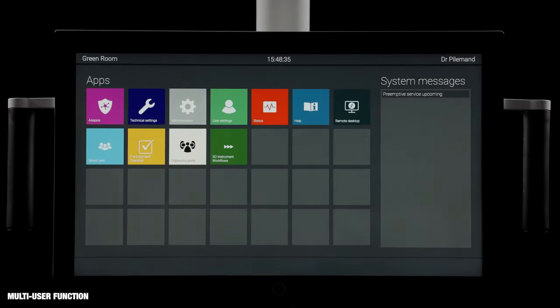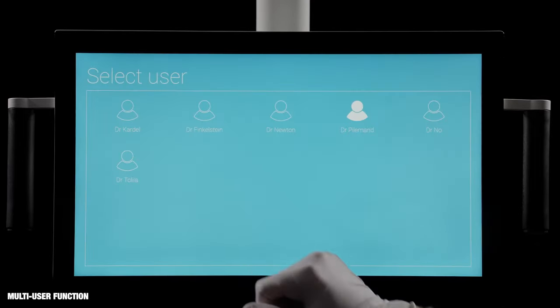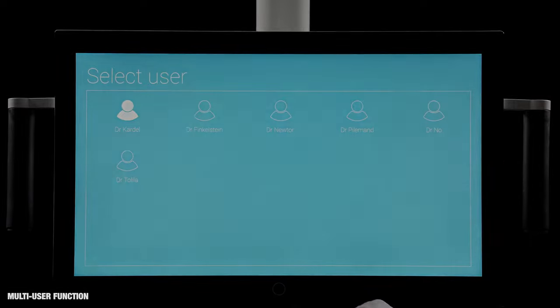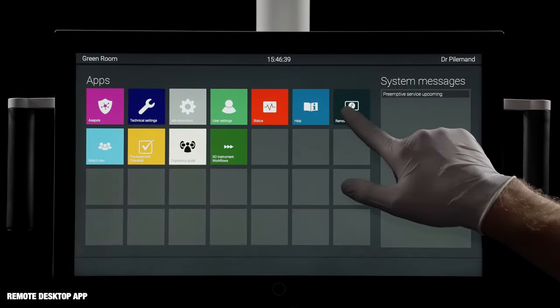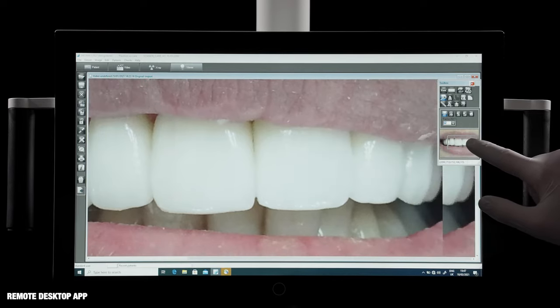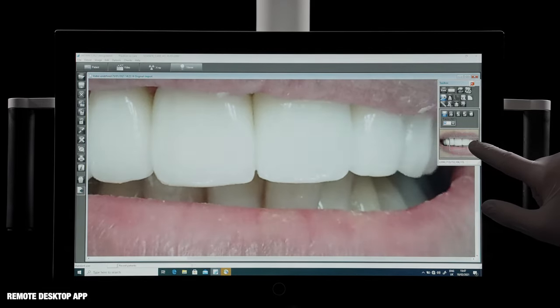Each user has a profile that stores individual settings, and all user profiles are accessible from all units in a network. The remote desktop app makes it possible to connect ExoFlow to other dental devices and software solutions in a network.